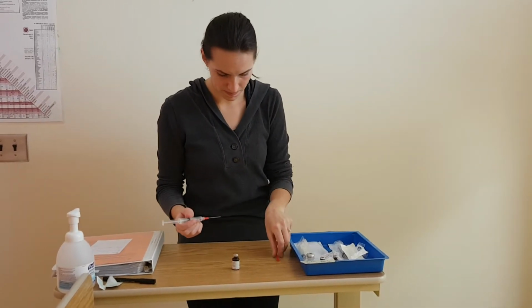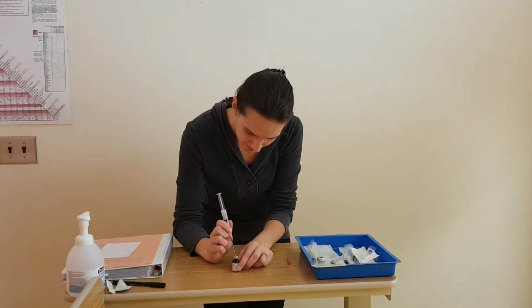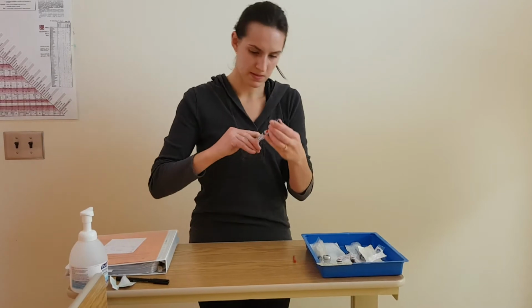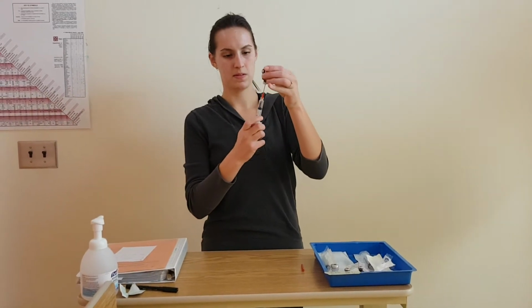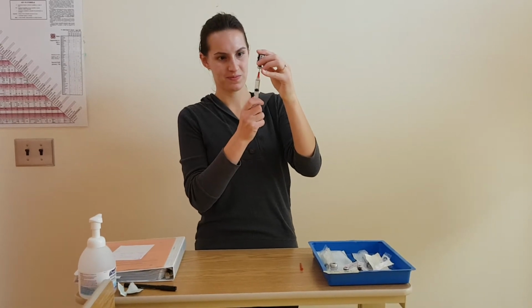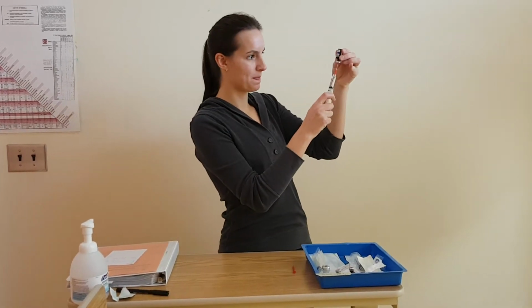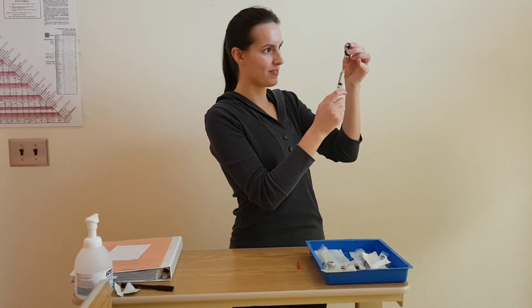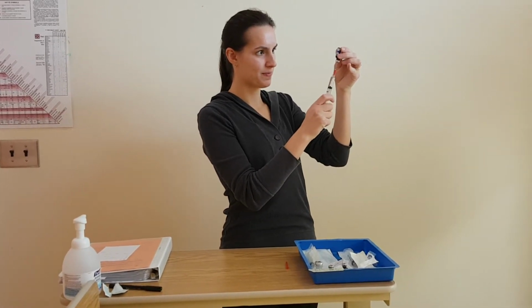Wait, we need to stop this. Actually, it's our second time doing it, so I just stop my rate. Okay, so we're going to draw up 4 milliliters here. That's okay. I just don't really know what to do about mine. Like, my numbers, just put maybe 0.